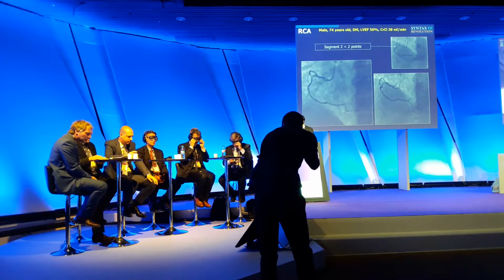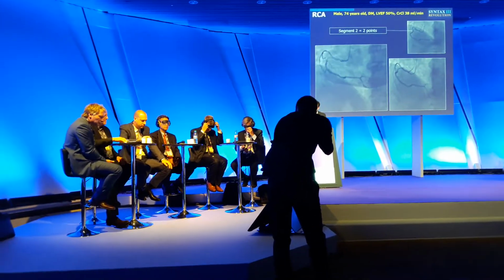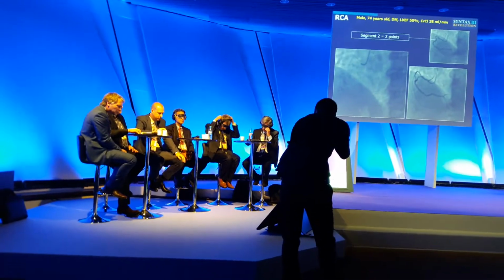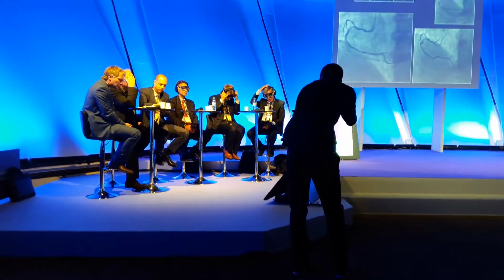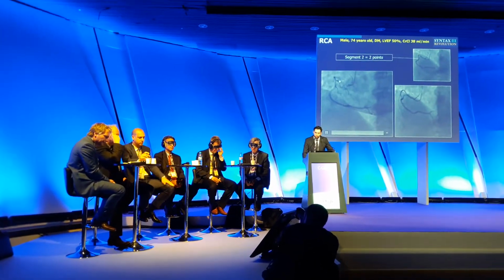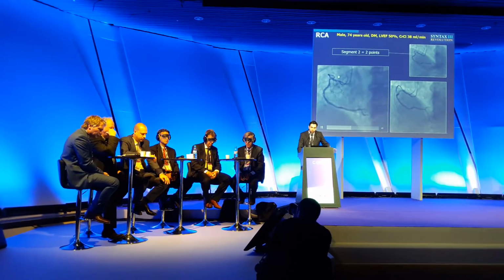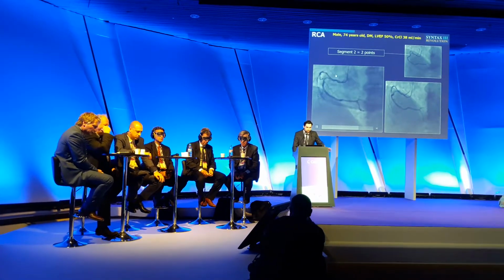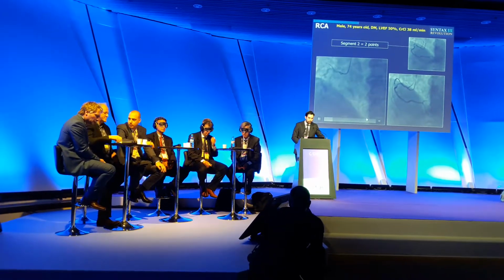I'm going to remind you the heart team of UC Brussels. That is a male, 74 years old, diabetic, moderate ventricular ejection fraction dysfunction, and a moderate renal dysfunction. You can see here the RCA. In the angiogram, we have a lesion in the proximal part of the RCA, which was judged to be more than 50% stenosis. Therefore, it was scored for the anatomical syntax score as 2 points.